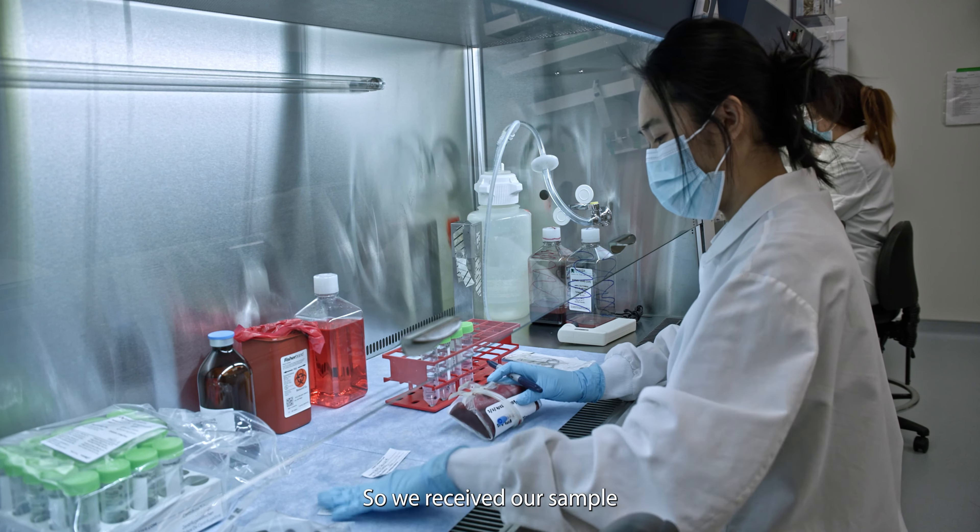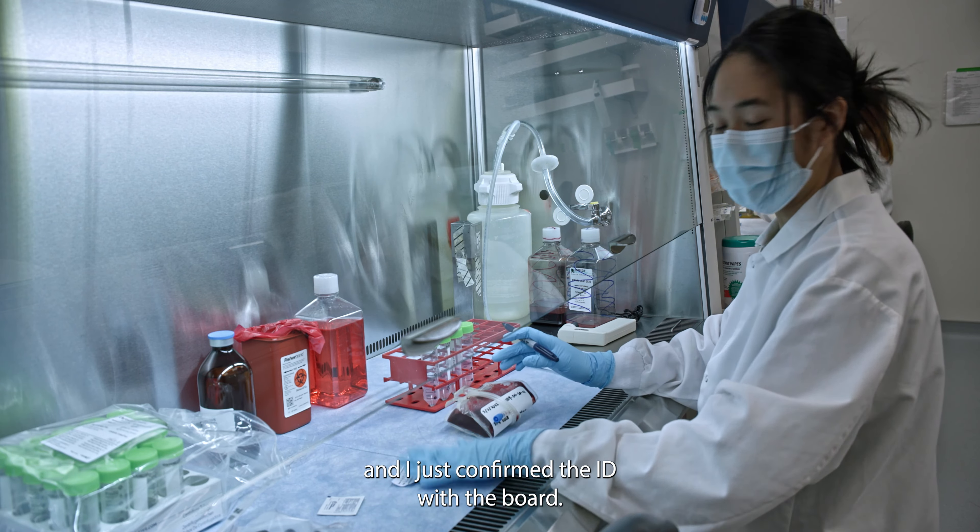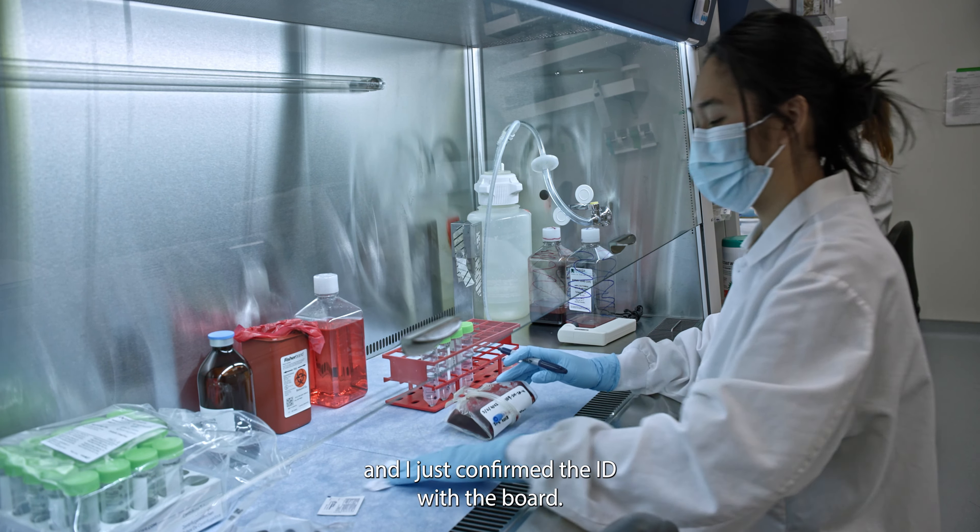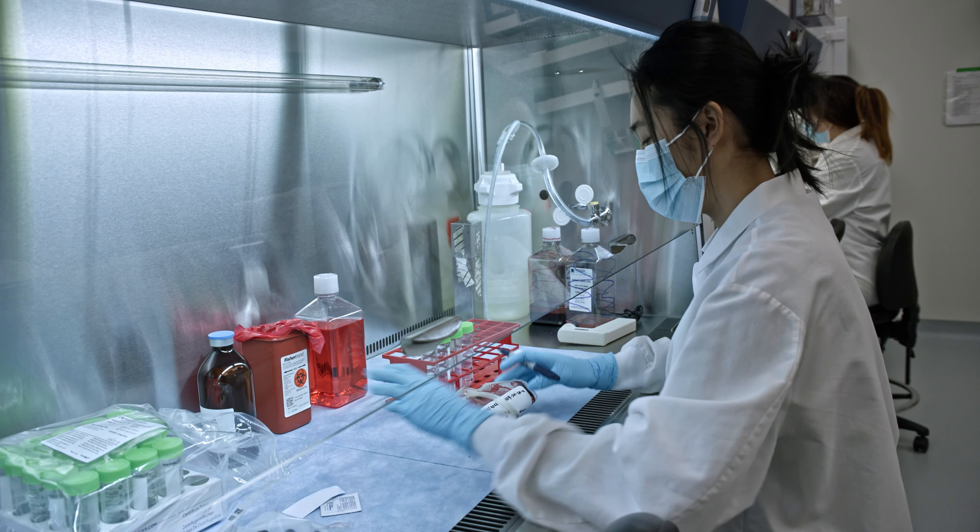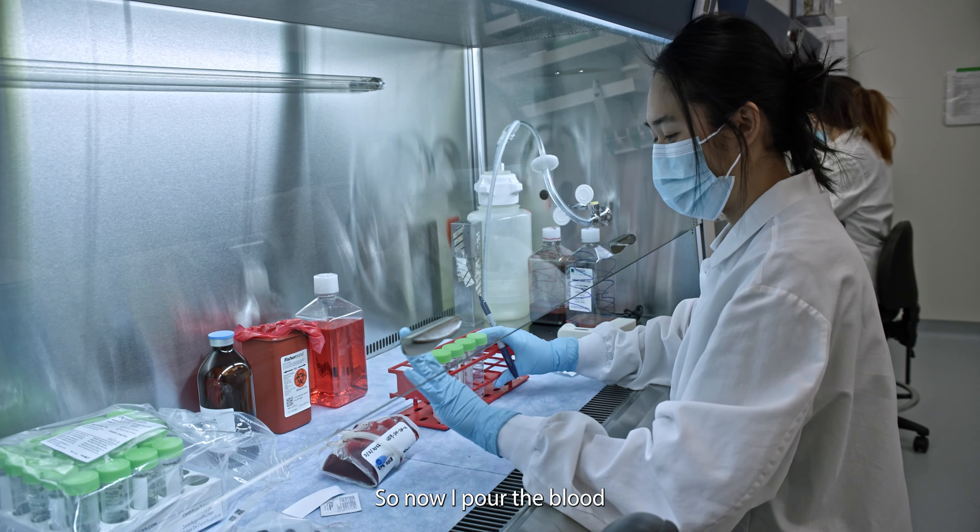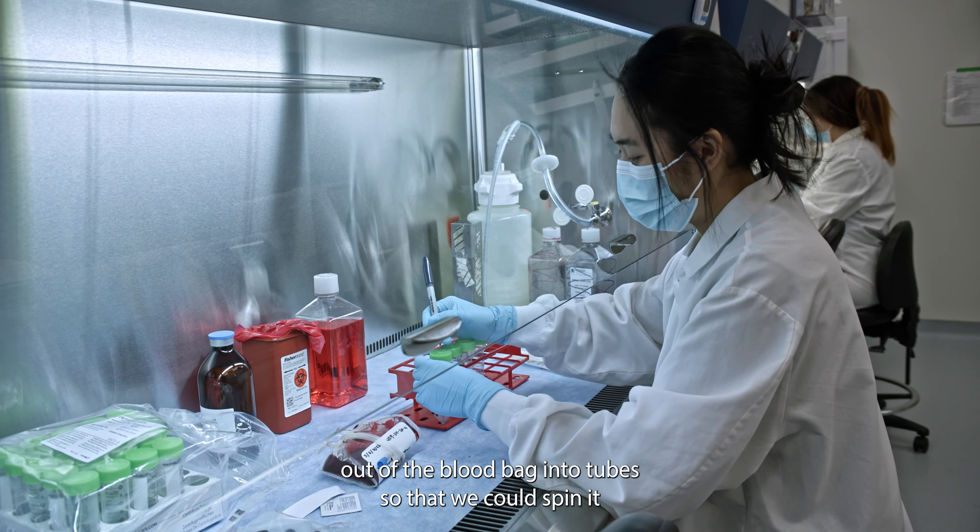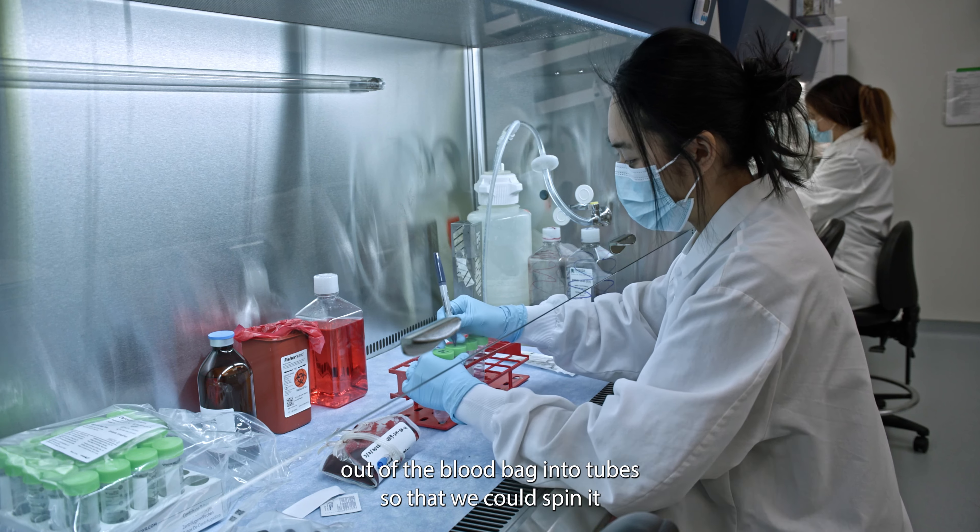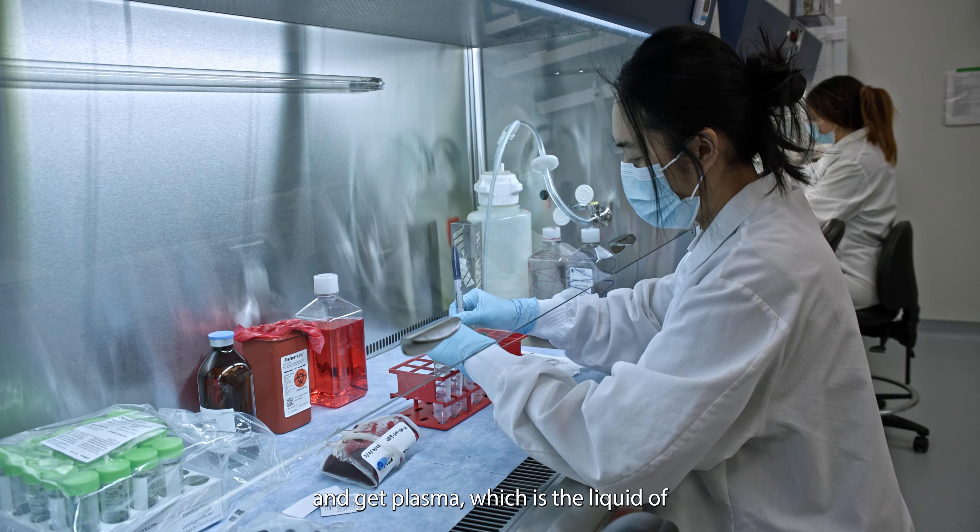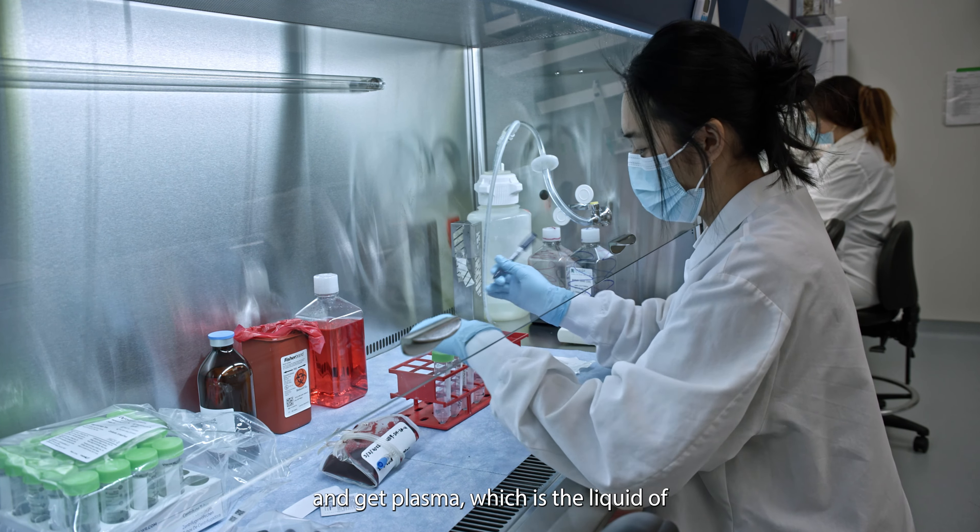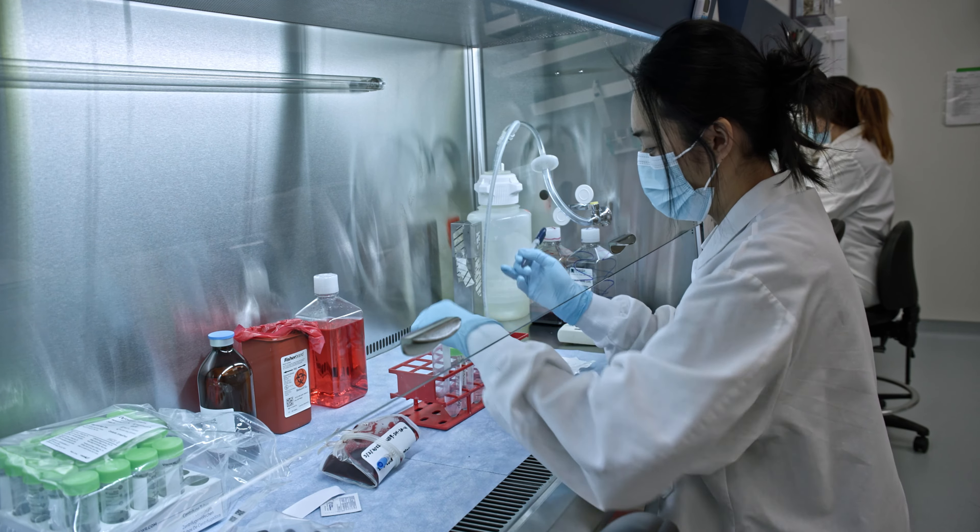So we received our sample and I just confirmed the ID with the board. It looks good. So now I pour the blood out of the blood bag into tubes so that we could spin it and get plasma, which is the liquid of blood.